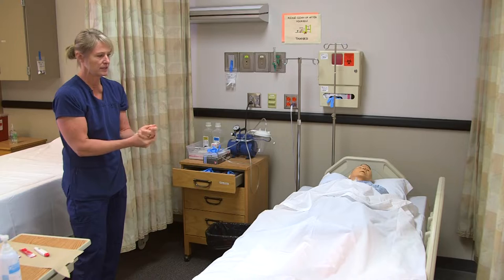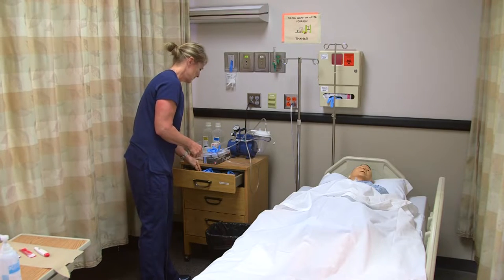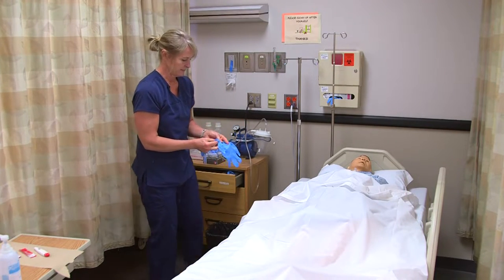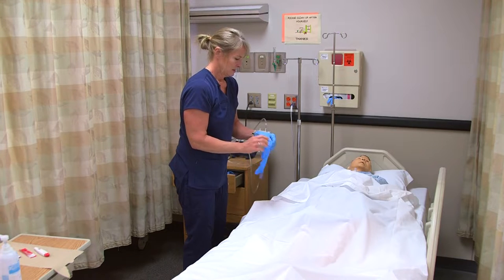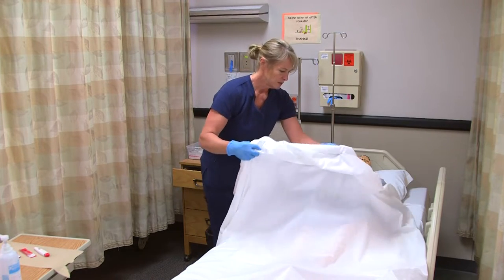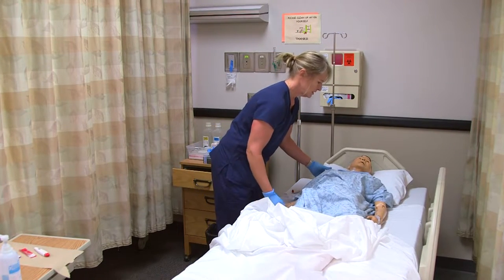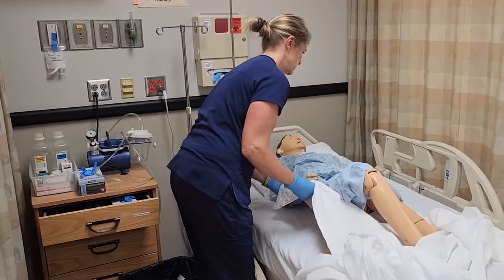I've already raised the side rail because I need to roll to the Sims position. I'll close this curtain and raise the bed up to my working height, then put my gloves on. 'Lee, I'm going to roll you onto your left side into the Sims position — I'm going to use the lift sheet and have you scoot over towards me on three. One, two, three.' Then I'll raise your right knee and roll you to the left. One, two, three.